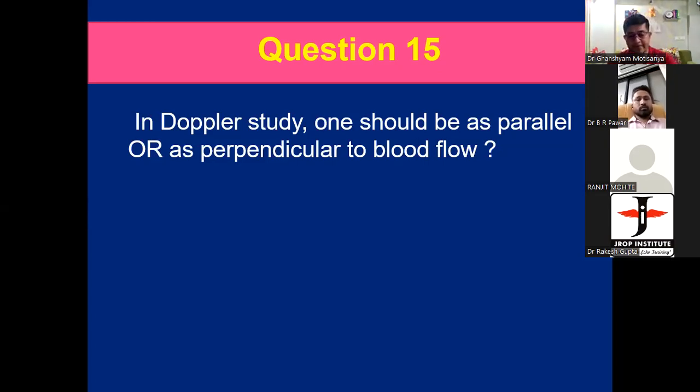Last question: like Dopplers are parallel, what should be perpendicular? For M mode, we should be perpendicular. What about 2D, perpendicular or parallel?